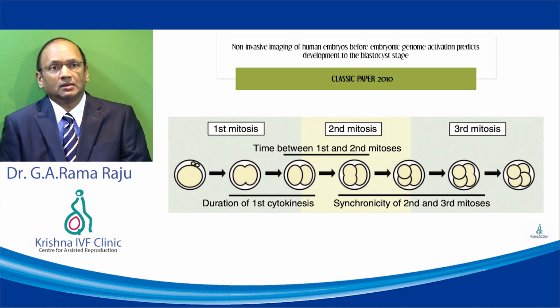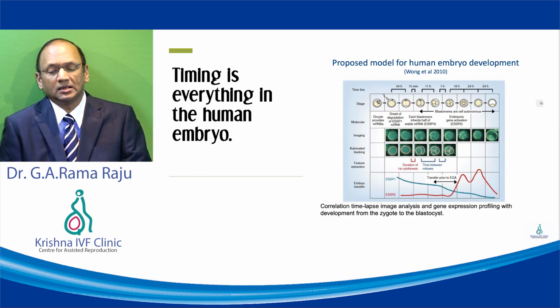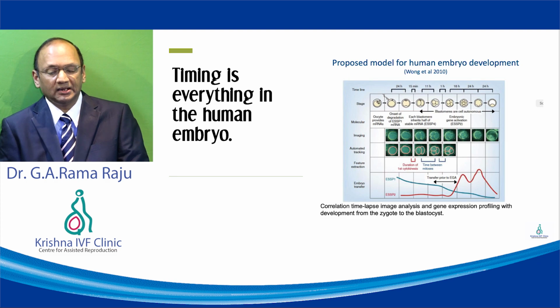This is the classic paper which everybody interested in time-lapse technology should read. In subsequent work he went further and did mRNA and gene studies to look at which genes are activated at different timelines. Here you see the timelines and the genes that are activated, and this happened in 2010.